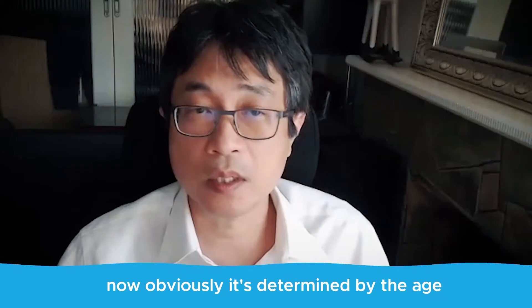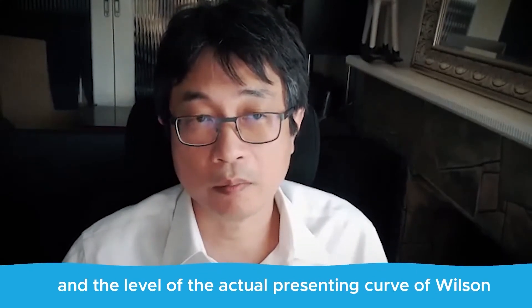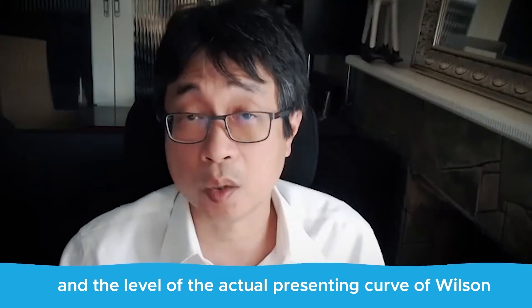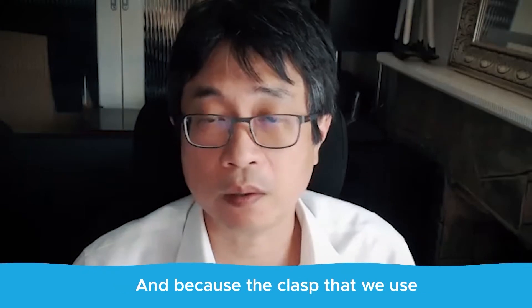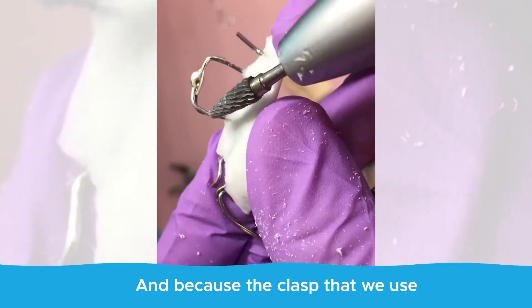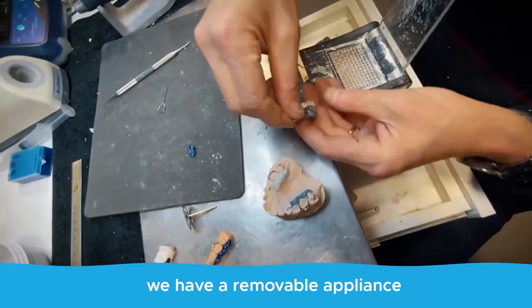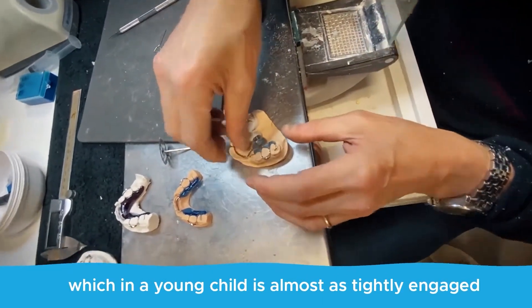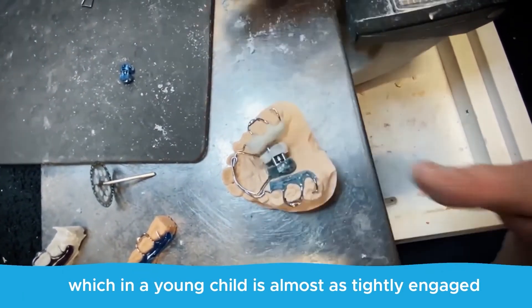Obviously it's determined by the age and the level of the actual presenting curve of Wilson, but we can consistently get that result. And because the clasps we use — which are Crozat-type clasps — we have a removable appliance which, in a young child, is almost as tightly engaged as a fixed appliance.